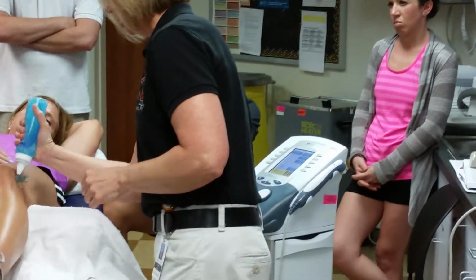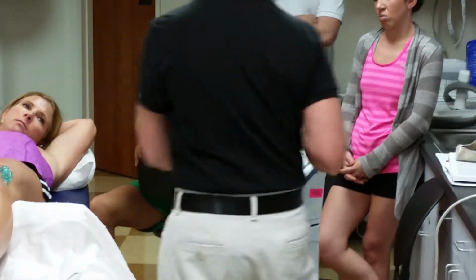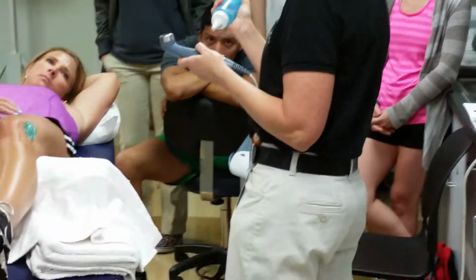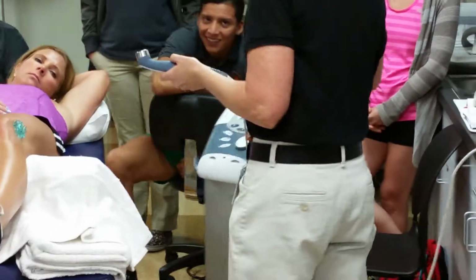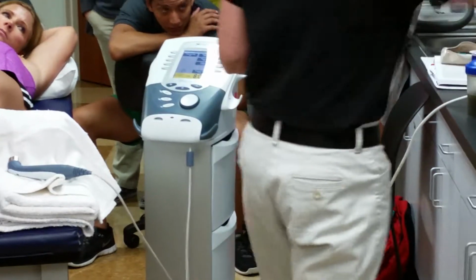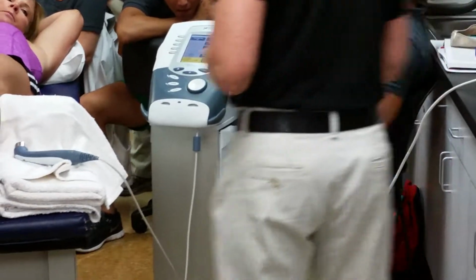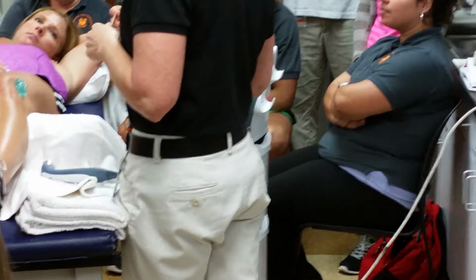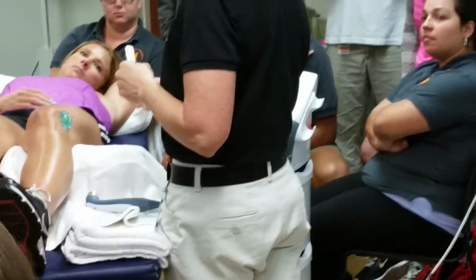Just be aware. Now the amount of gel, I usually put the gel on the person. I've seen therapists who put the gel on the sound head. I don't know, I feel like you never can have too much gel. Because what happens is, as you're doing it, it drifts away, and you end up not having enough gel. It won't transmit. If you're moving the sound head and it's actually sticking to the person, you don't have enough gel.